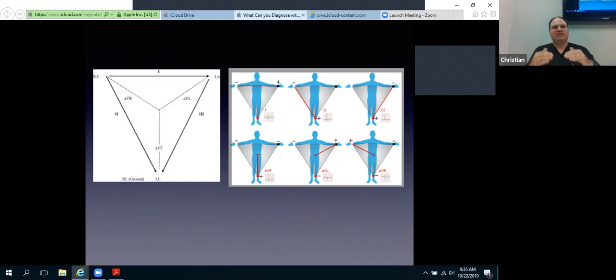The reason why it's less positive than the other is that you're on the left side of the heart and the majority of that side is firing. So you're only picking up the subtle differences between the upper and lower portions of the heart, but you're on the same side. So if you have two people on the same side of an event, looking at an event, they both give you pretty much the same signal.